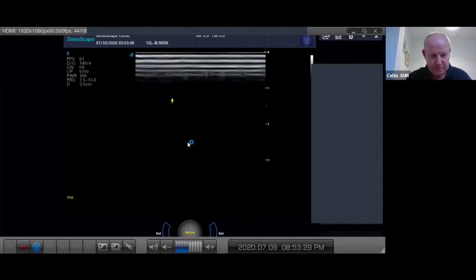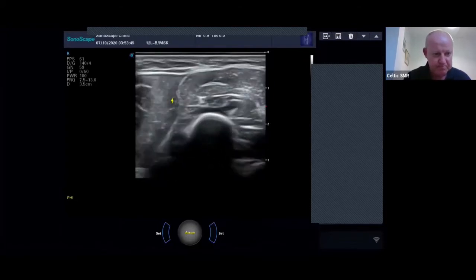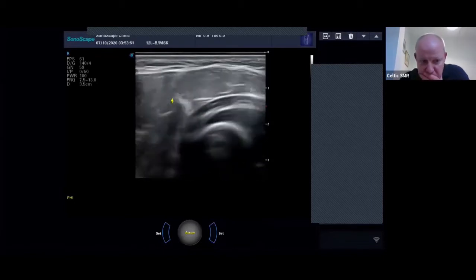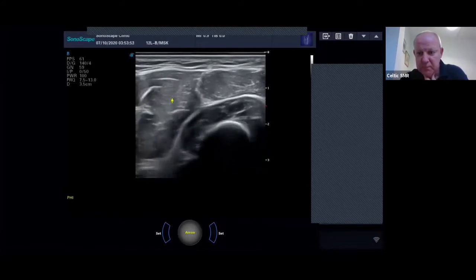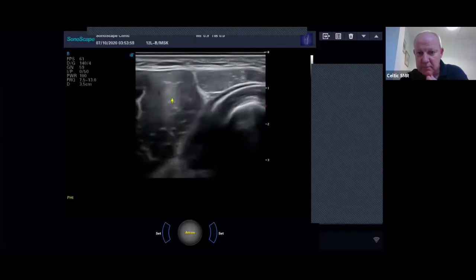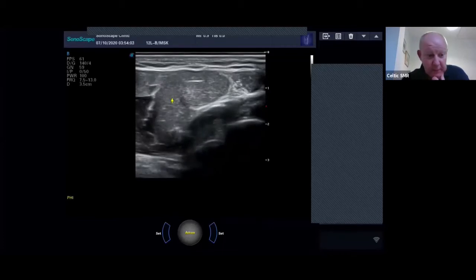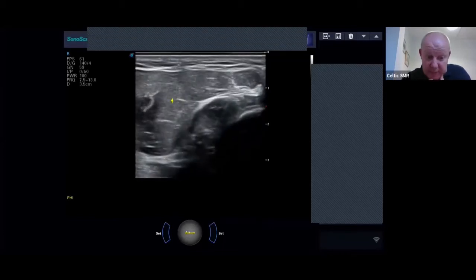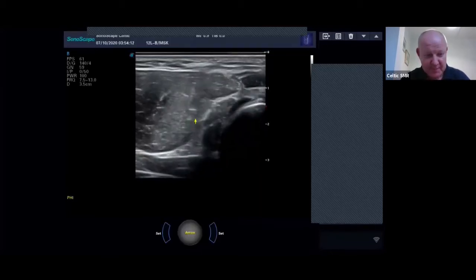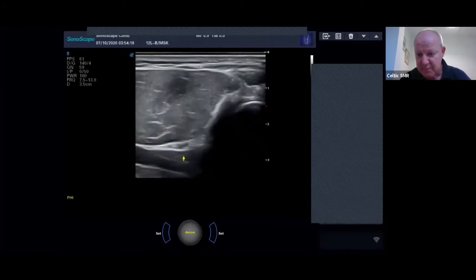I don't use it myself, but it's basically you have the radial as like a cotton reel, and then as they're pronating and supinating, you can see the biceps tendon underneath. I find it a bit fiddly, and I'm not very good at it, to be honest, so I don't tend to use it, but I think he's talking about this cotton reel view. So you can see how we're just twisting there, and what's happening is, you get the arrow, the biceps tendon is under here somewhere, if you just keep twisting that bit.